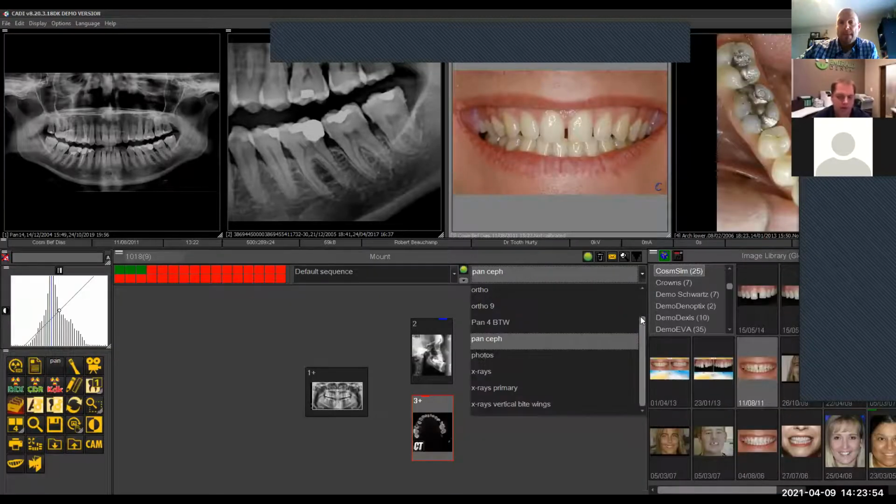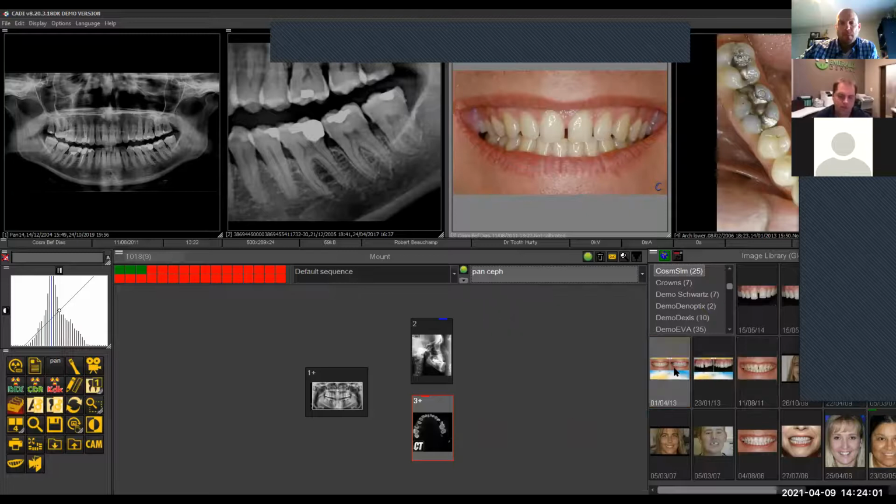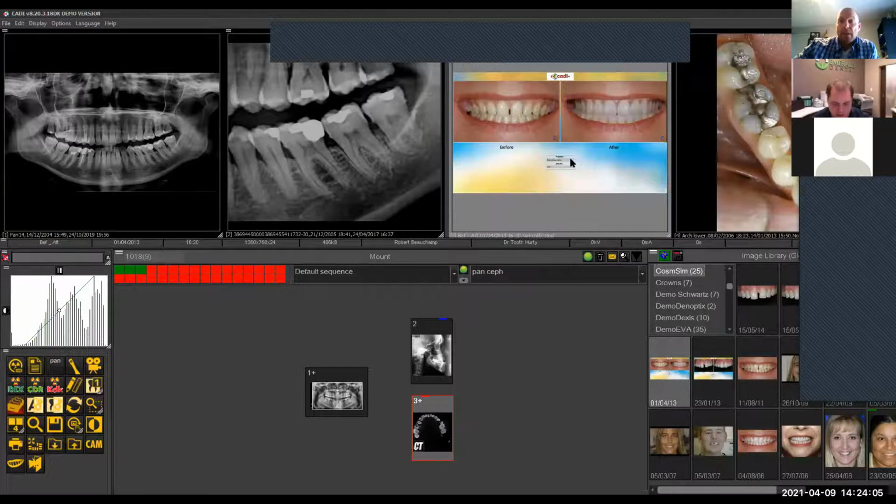You're talking about the Smile library. That was something I was going to ask. I know we develop our own libraries, as I got pictures, and I think that's fantastic. But there is a stock library. Is that what you're referring to, the Hornbrook one? Is that something different? Just explain to me the difference.